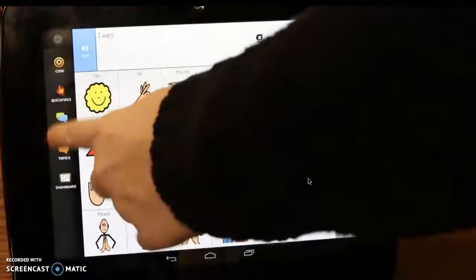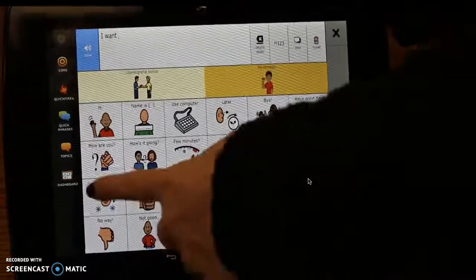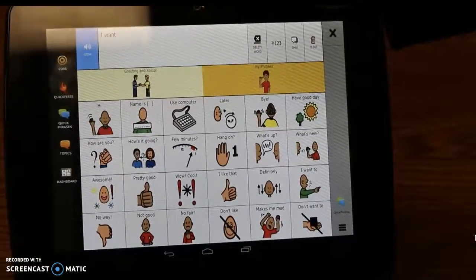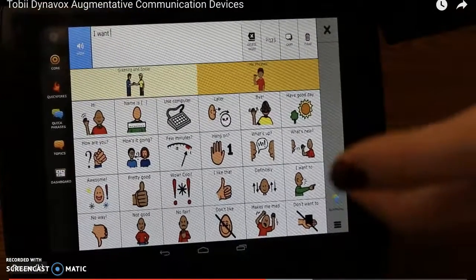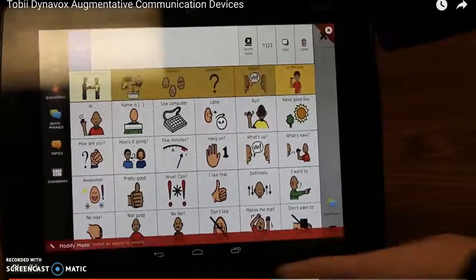Our quick phrases are similar. We really want to keep people social as well here. We have words like awesome. So many kids want to say that things are awesome and cool. And this is a way that they can do it with one button. After they've learned the word, they can use this phrase. So we can hide different buttons when we want them.